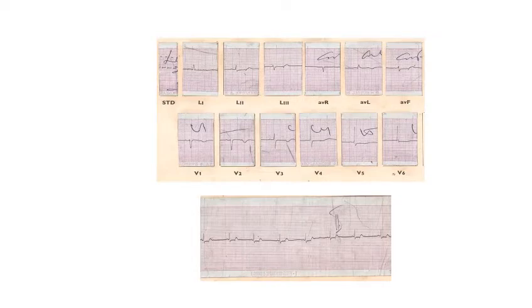What is the duration of the ST segment? Prolonged QT, and mostly the ST segment is prolonged. What are the conditions in which the ST segment can be prolonged? QT prolongation, long QT syndrome. Sir, there are some drugs which can cause it, like amiodarone, amitriptyline, antihistamines. Okay, what are the conditions where the ST segment prolongation is more pronounced than the actual QT prolongation?